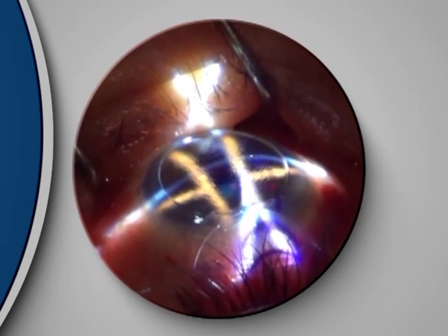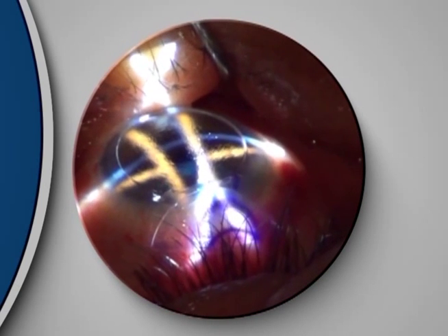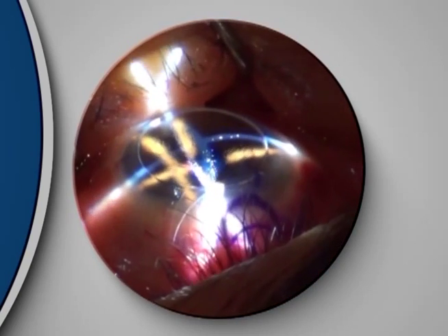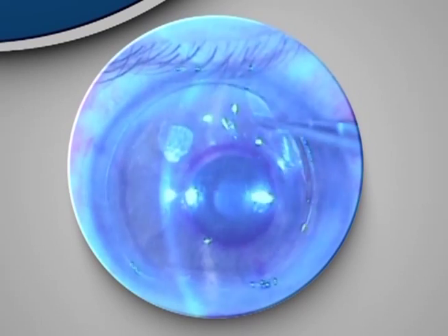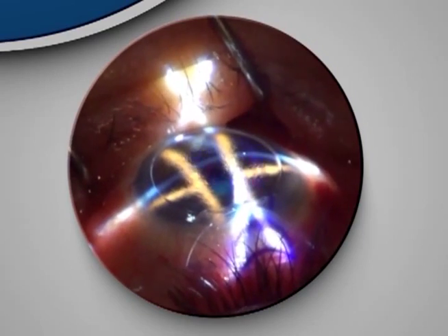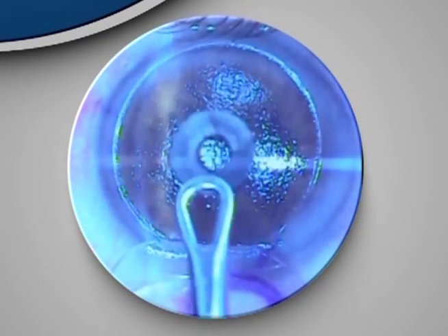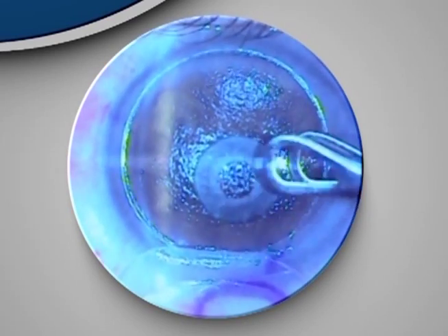Enhancement: if you decide to enhance, you need to lift the flap, remove the inlay, photo-ablate, then reposition the inlay. At this stage you are not sure you are putting the inlay in the right position or not.